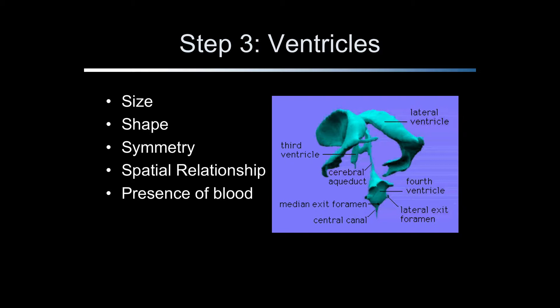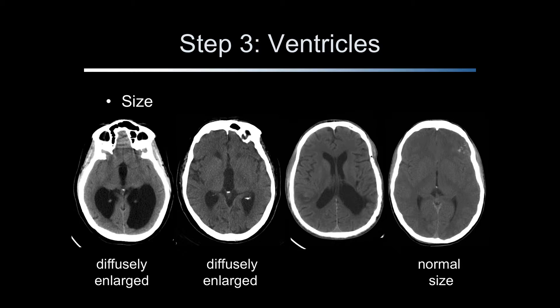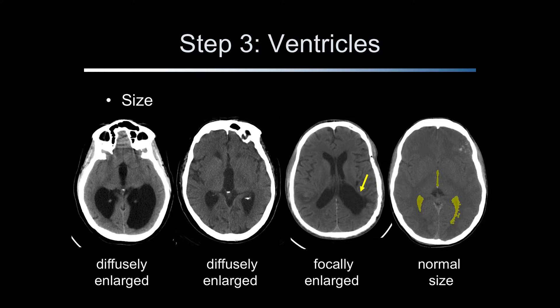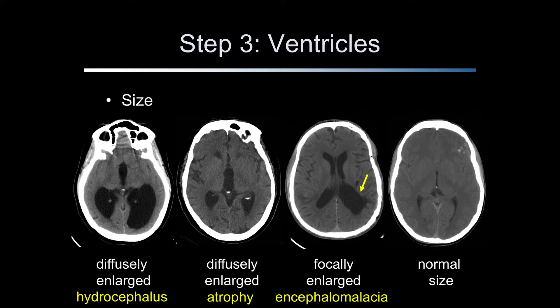Step 3 in the evaluation of the head CT scan is to examine the ventricles, which are cerebrospinal fluid spaces. Size, shape, symmetry, spatial relationship, and the presence of blood are features which require examination. Ventricular size may be enlarged diffusely or focally, as compared to normal-sized ventricles. Increased size is either due to loss of brain tissue from atrophy or encephalomalacia, or from increased amounts of cerebrospinal fluid from hydrocephalus. The encephalomalacia demonstrated by the arrow is due to a previous stroke.